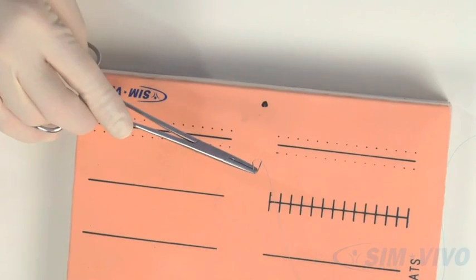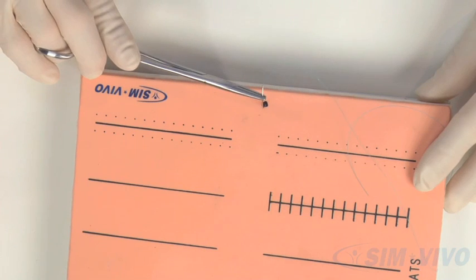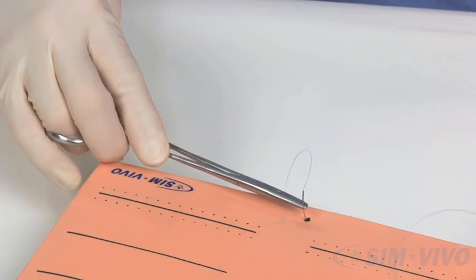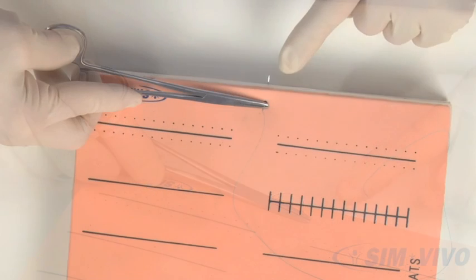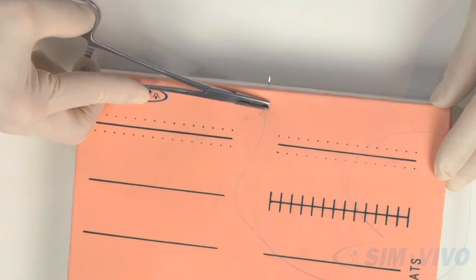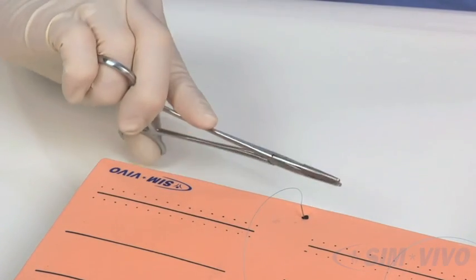Now, let's practice on the board. Put the point of the needle in contact with the dot that you made on the suture board. Now gently rotate your hand so that the tip of the needle will follow a curving motion that replicates the curve built into the needle. As the needle comes out of the foam, rotate further so that 2 to 3 millimeters is exposed. Now release the needle by pushing and spreading your thumb to disengage the ratchet.